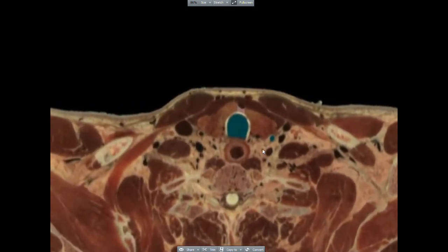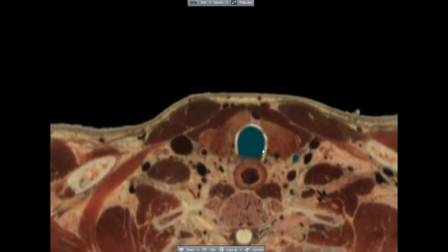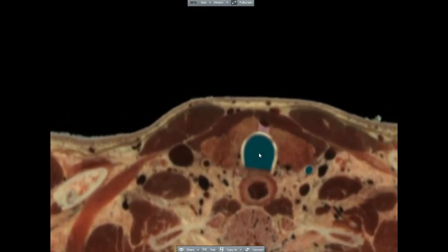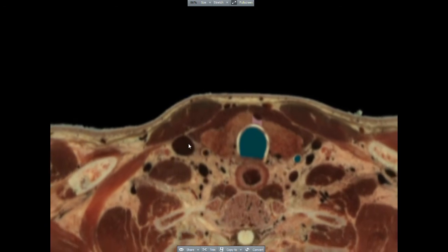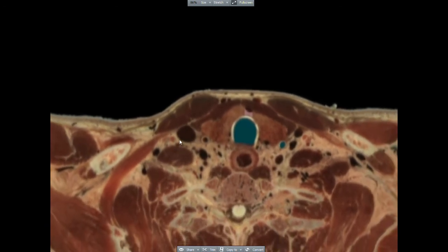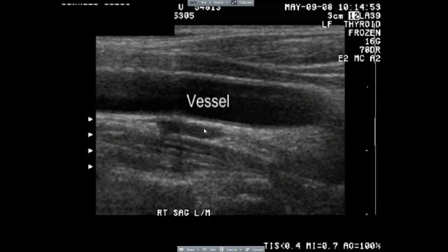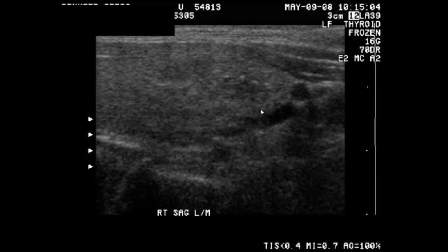Bringing these views again to VH Dissector, we once again orient ourselves and notice that the internal jugular vein lies much more lateral than the carotid artery, which lies more posterior in these images. Here, this vessel is most likely the internal jugular vein, although because it's not compressible, we're not sure.